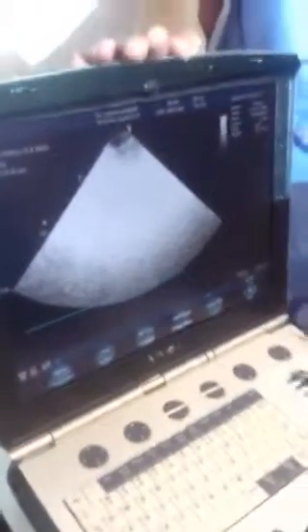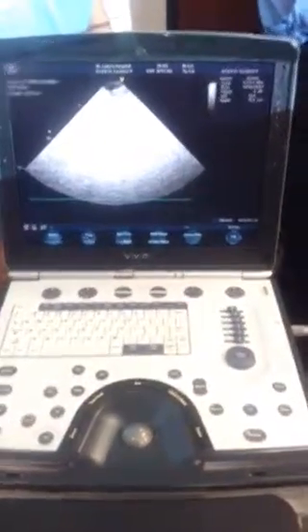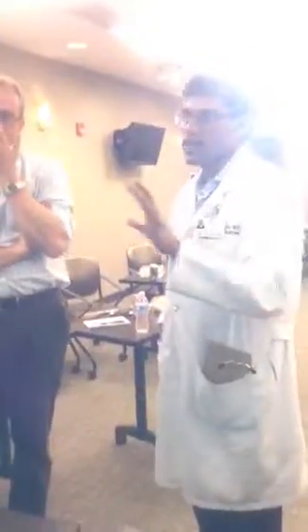And then from there, we need to know how to upload. So maybe we can go down to lab and figure out how to do that. We're going to actually take the machine like you would do in real time, and we'll try to float these images to Synapse, and then from Synapse to Epic. And while we do that, not now, but you can actually make a video of doing that, because that's a huge challenge.